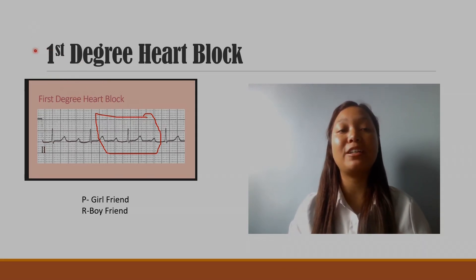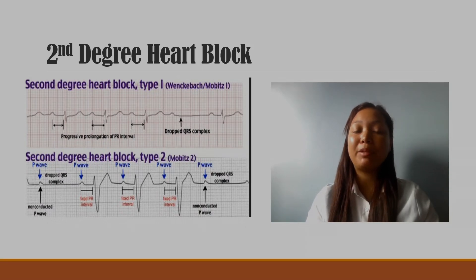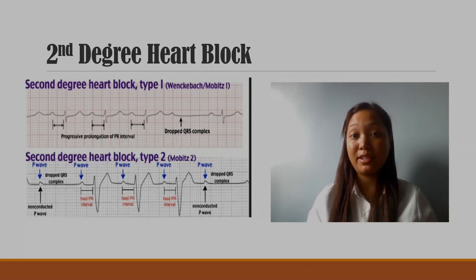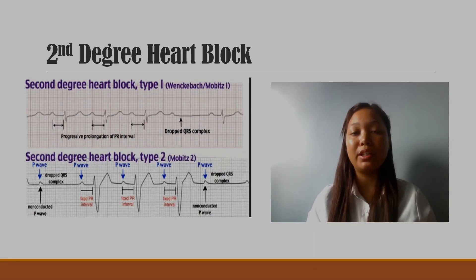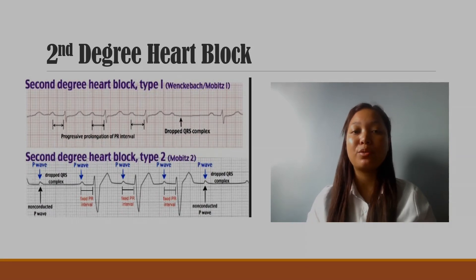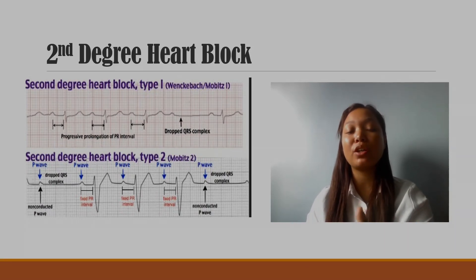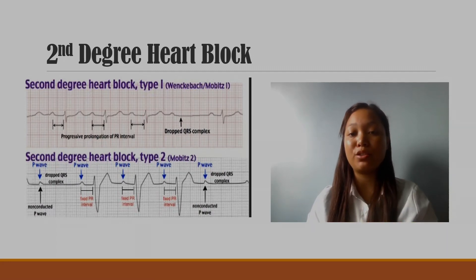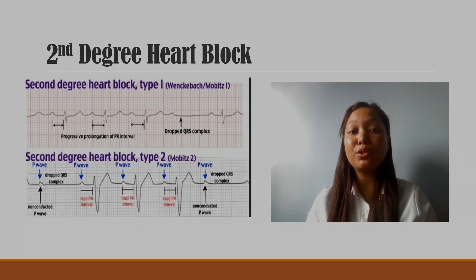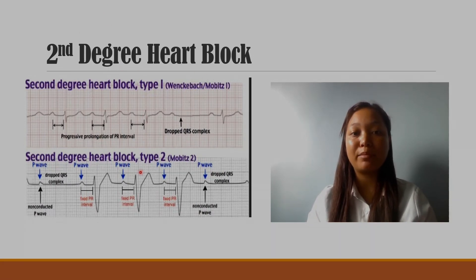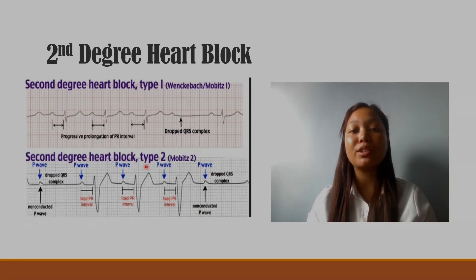What is the second degree of heart block? The second degree heart block also has a break in conduction. Let's see how it will happen. There are two types of second degree heart block: Type 1 and Type 2.